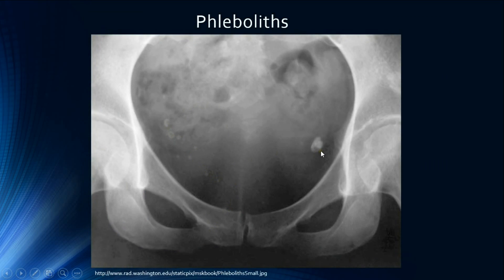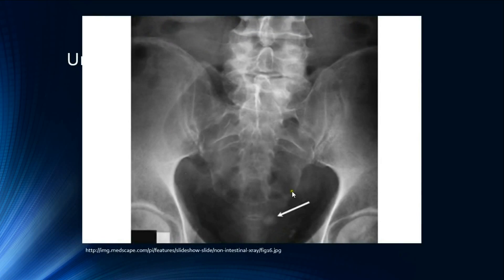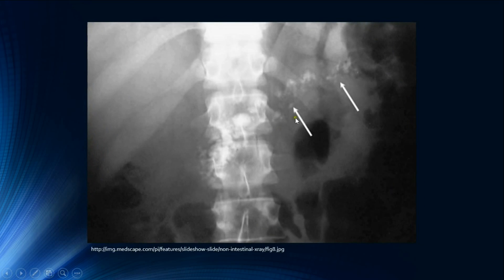To differentiate ureteric stones from phleboliths: phleboliths have a central lucency surrounded by calcification (calcification in vein walls), whereas ureteric stones show a peripheral lucency with central opacity, known as the soft tissue rim sign. Here is a radiograph showing multiple tiny calcifications consistent with chronic calcifying pancreatitis.